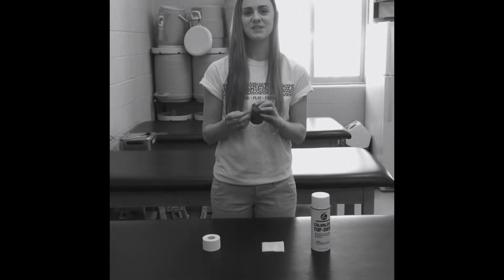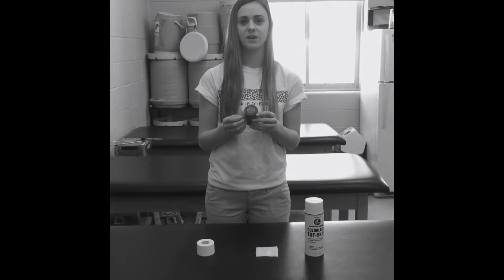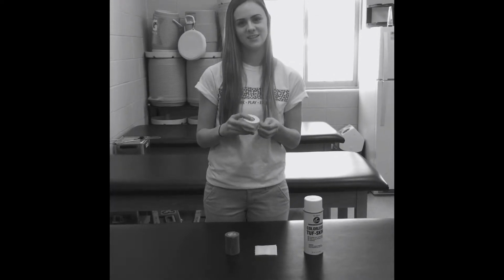The third material used is pre-wrap. Pre-wrap is mostly used for the comfort of the athlete and is also used as a barrier to protect your skin and or leg hair from the tape. Finally, the most important material is your athletic tape.